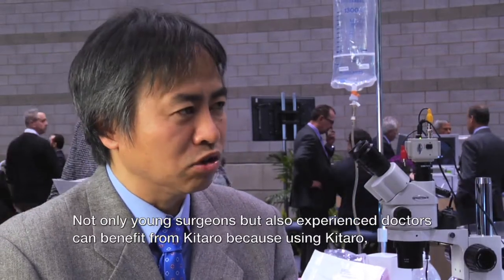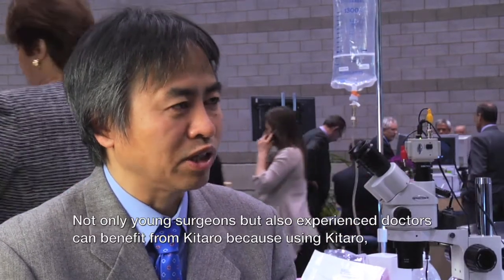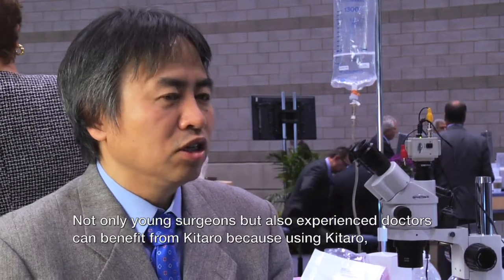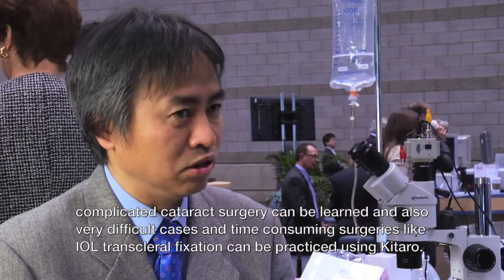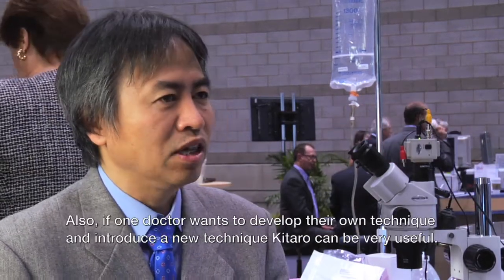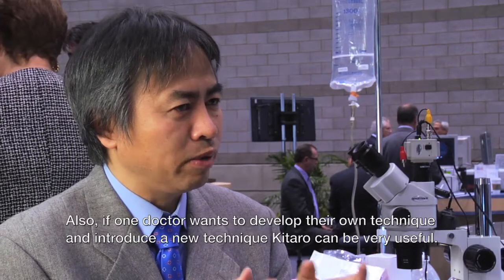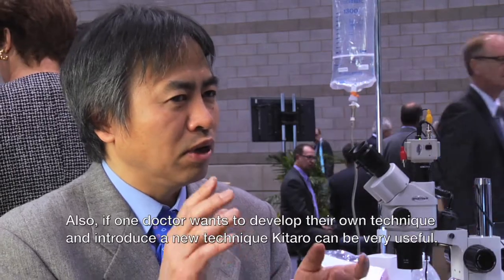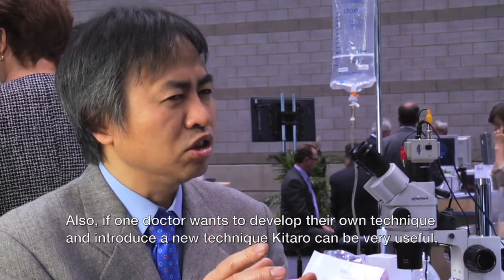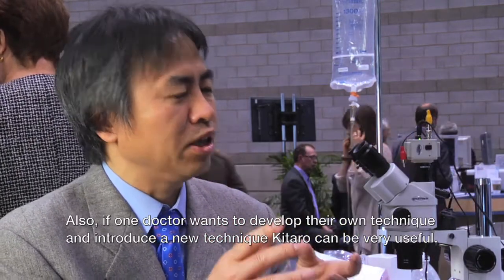Not only young surgeons, but also experienced doctors can benefit from Kitaro. Because using Kitaro, complicated cataract surgery can be learned. Very difficult and time-consuming procedures like IOL trans-scleral fixation can be practiced using Kitaro. And also, if one doctor wants to develop or introduce a new technique, Kitaro is very useful.